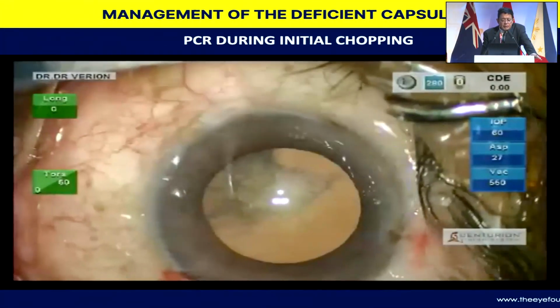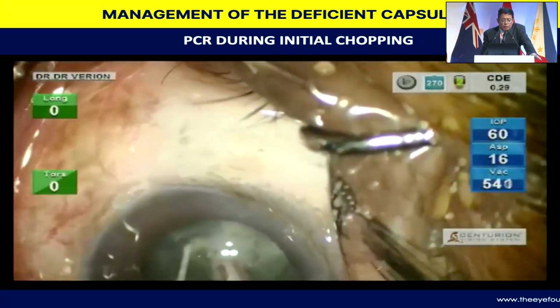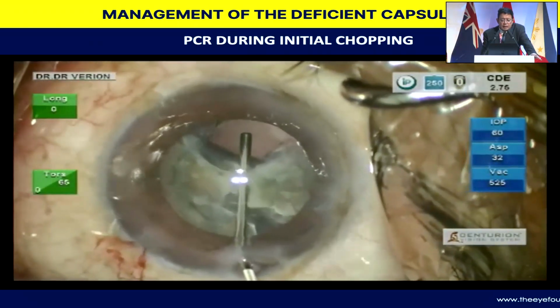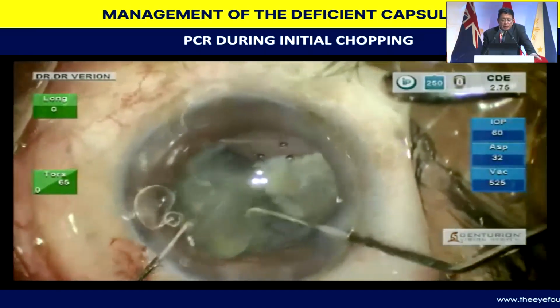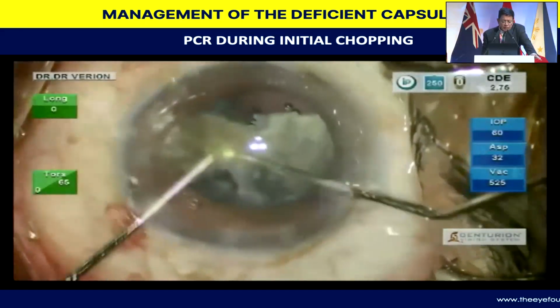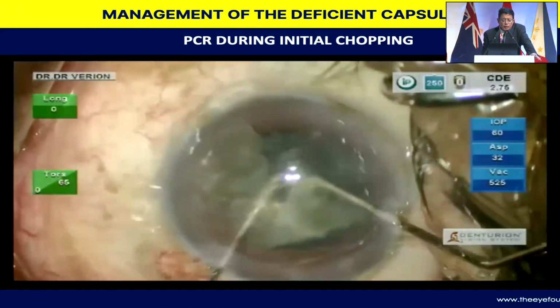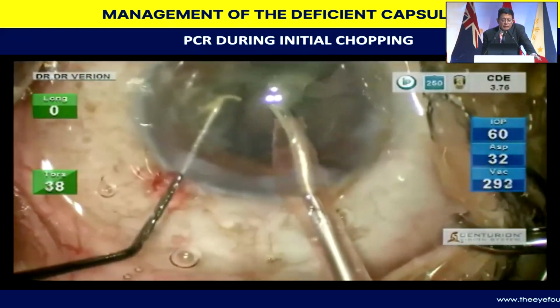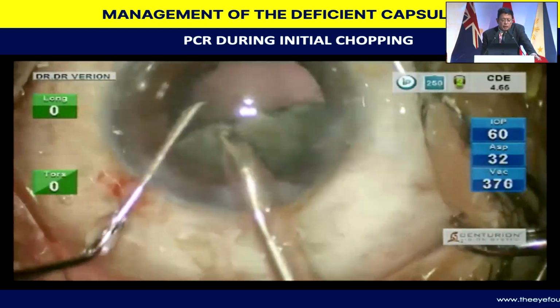And what about a PC rent during initial chopping itself? This again is a fairly routine case, a walk in the park case. But here, I have a PC rent, and what I do is to immediately tamponade the anterior vitreous face with dispersive viscoelastic, bring whatever nucleus fragments are there into the anterior chamber, and then with adequate covering of the endothelium, I go ahead and remove the nucleus fragments over there.